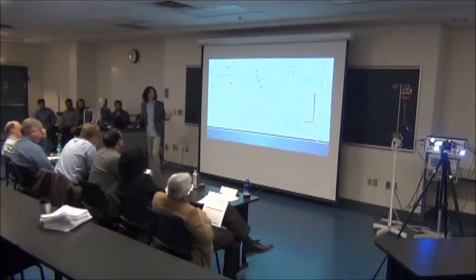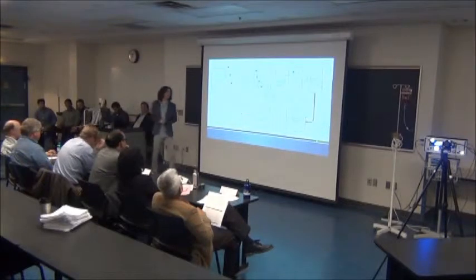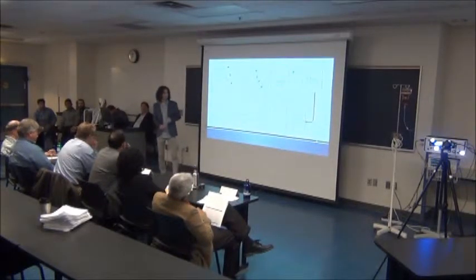Closing the switch will pass 5 volt to the relay coil, and these relay coils are rated for 5 milliamp. It's very low current, which is very important to work with these types of switches. Now when the relay coil is energizing, this relay coil will close this contact. We don't have only one contact, we have different contacts and different relays.